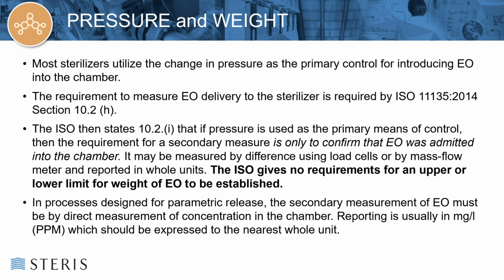Now, processes for parametric release. You do have a secondary measurement for EO concentration to be measured in the chamber. We will be having another seminar in a couple of weeks, on June 23rd, that talks about parametric release, and we'll have a lot more information on how to do that, what's to be done, etc. So I would greatly encourage you to tune in at that time. Again, June 23rd for parametric release.